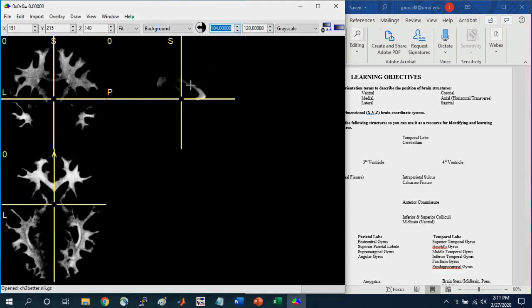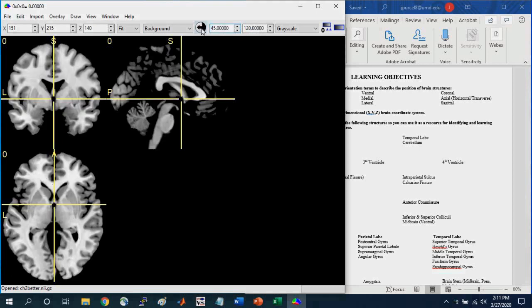And so the minimum now is 45. And so if I select this and just increase it, so now the minimum that we're seeing is 104. And it gets rid of all the darker regions in the brain, okay? If I want to go back to the default, you can select this icon here, and then it'll reveal the image again.